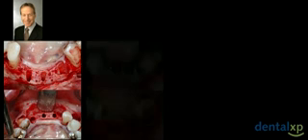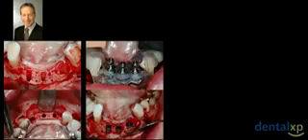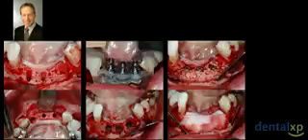So here we are. Well, this is not a surprise. These dehiscences we expected. So our bone graft materials have been selected, our membranes have been selected, the appropriate informed consent has occurred, the staff knows what's going on, this information goes beyond just what Scott and I have spoken about. It really has to do with managing our offices and managing our patients as well. So we do the usual stuff. We get stuff out of a bottle. We put a membrane over the area. We actually attempt to hope for the best.